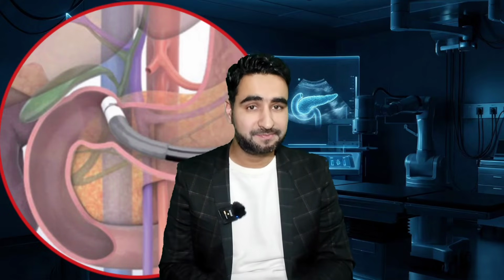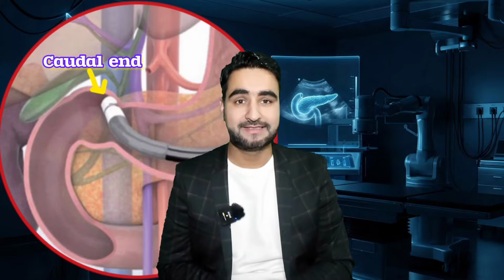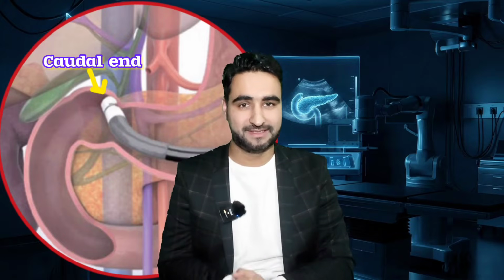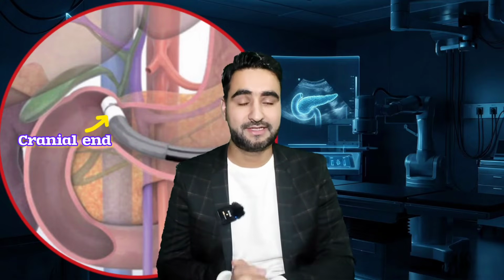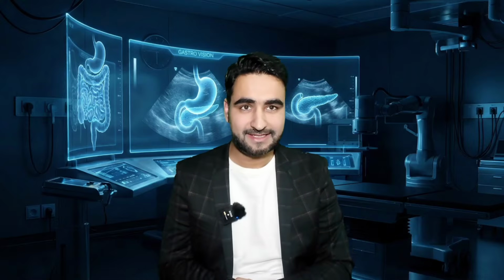Now, pay very close attention to what I am about to tell you, because this is the key that unlocks everything. At the duodenal bulb station, your transducer is essentially upside down compared to the GE junction station. Let me repeat that, upside down. What does this mean? The caudal end, that is the tail end of the transducer, is now superior, that's pointing upward. The cranial end of the transducer is now inferior, that's pointing downward. This is the complete opposite of what you have learned at the GE junction.